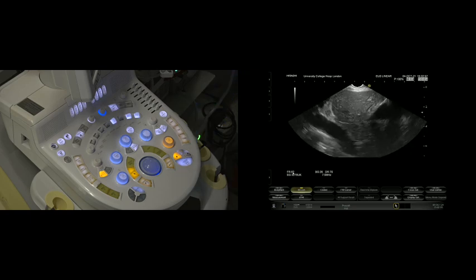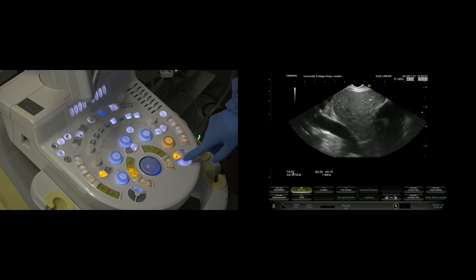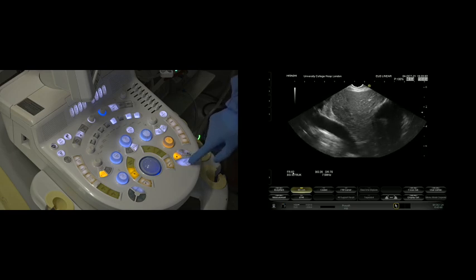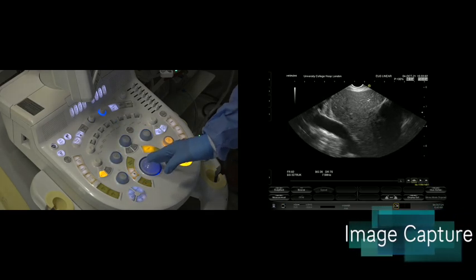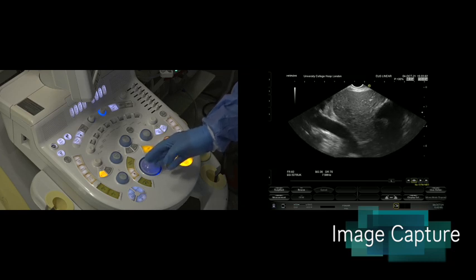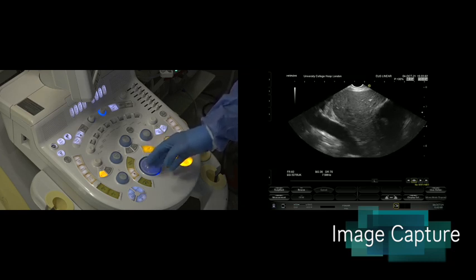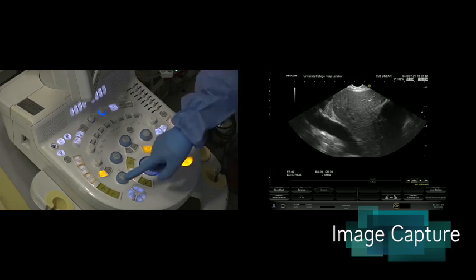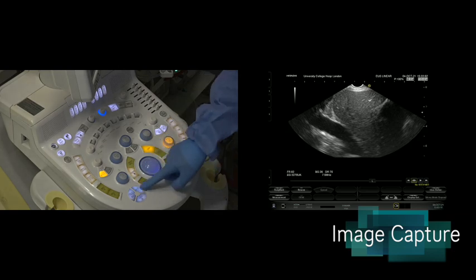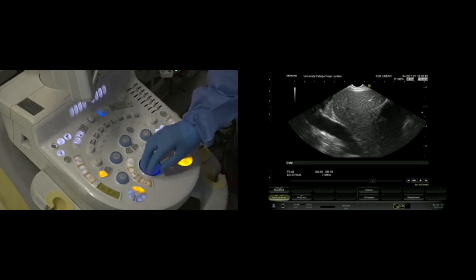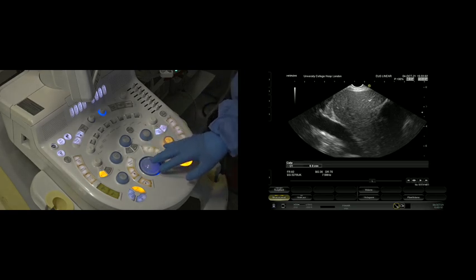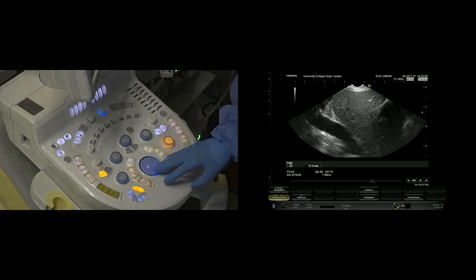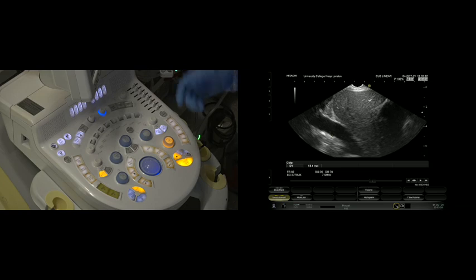That is the basic introduction to Doppler. Another feature is freezing and being able to wind back—really useful for important photo documentation. Then other features of this console include calipers. Not that you'd particularly want to measure the diameter of a portal vein as we're doing here, but that's how you would do that. That's really important for photo documentation of bile duct and pancreatic duct caliber.